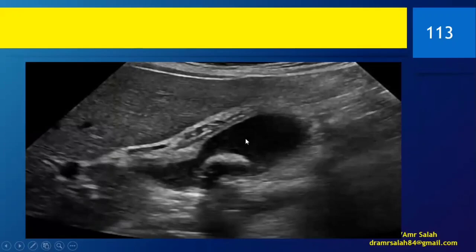Again, if we suppose that this patient has a history of right upper quadrant pain, and he has a positive sonographic Murphy sign, has fever and leukocytosis, I would suggest acute cholecystitis. Although the stone here is not impacted, it might have moved, and the gallbladder distension might have been relieved. However, I have here more than one criterion. This is very important, that you have to gather the criteria together. If you have enough suspicion, you would write that this is highly suggestive of acute calculous cholecystitis.